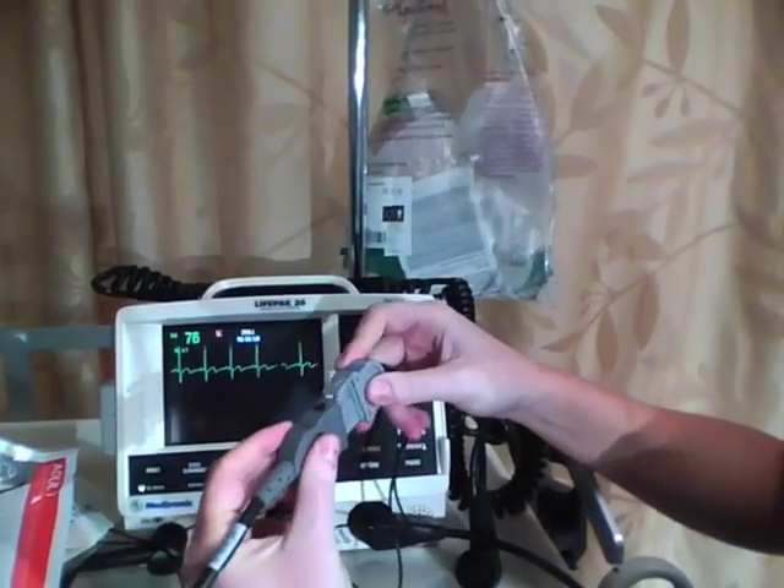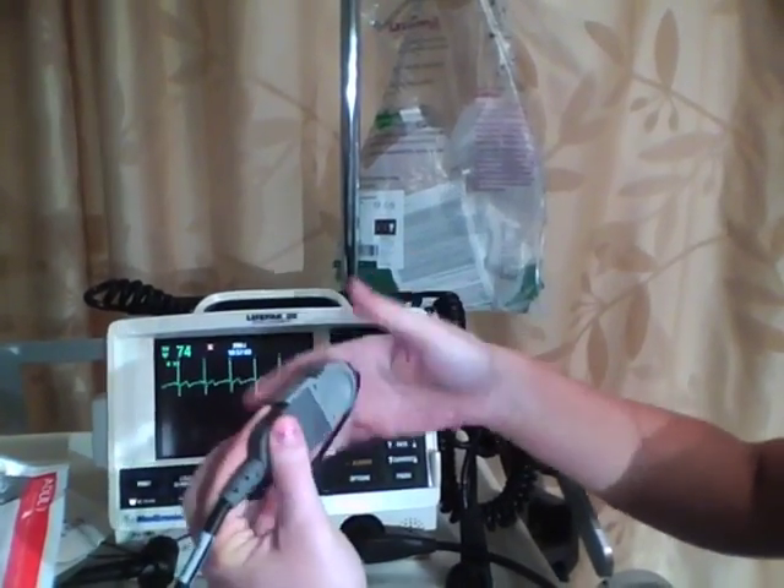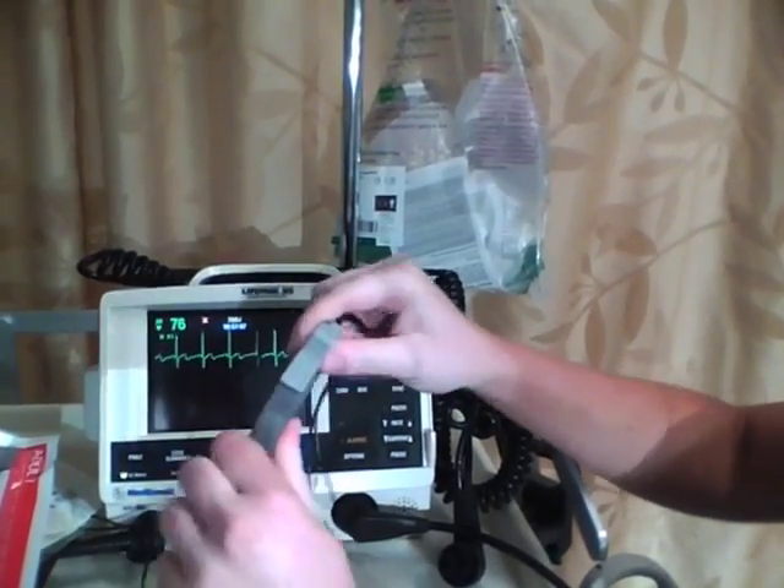Everything has arrows, so if you put it in the wrong way, there's only one way it goes. If you had it in the opposite direction, it wouldn't fit. So don't shove it in and try to break it — just line up the arrows.